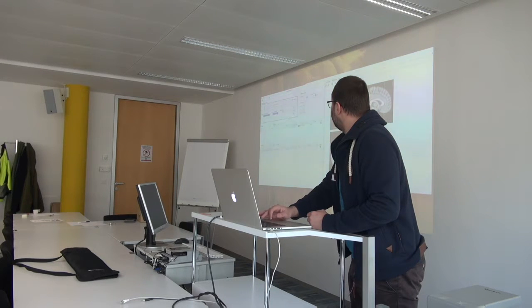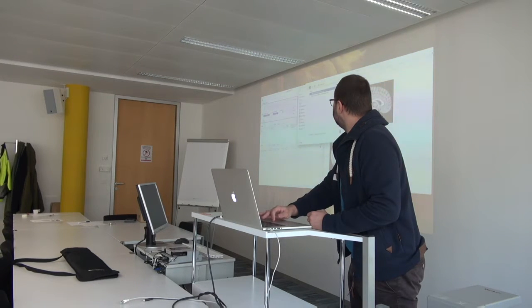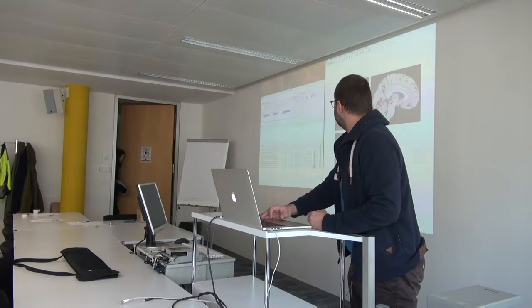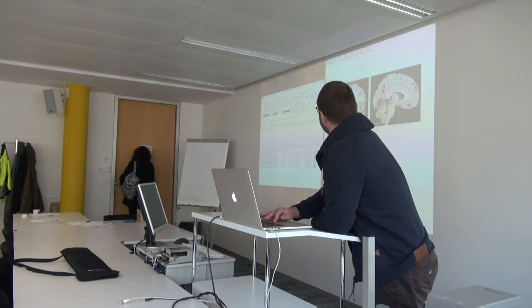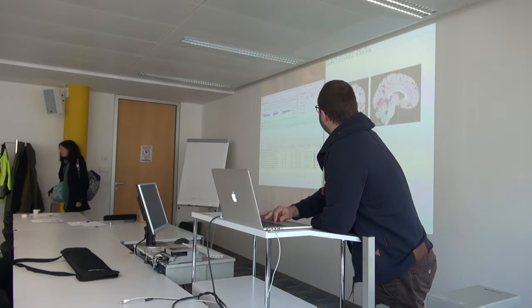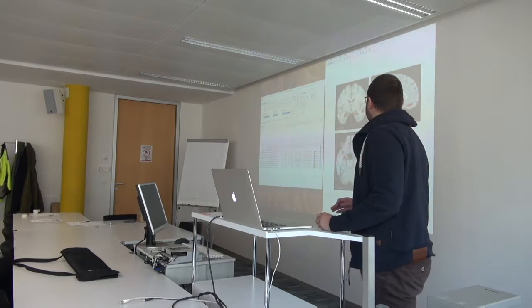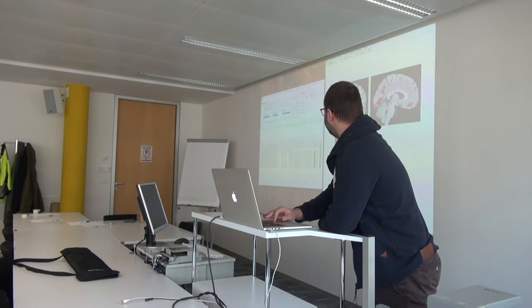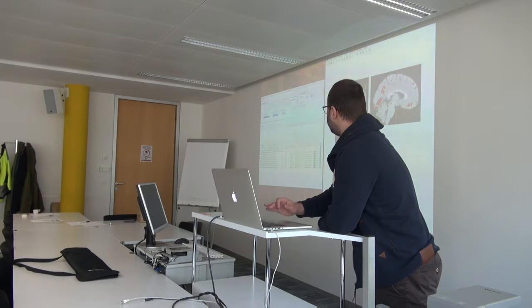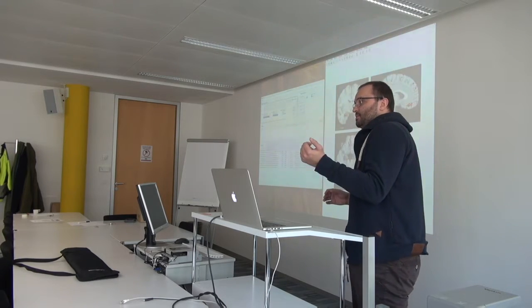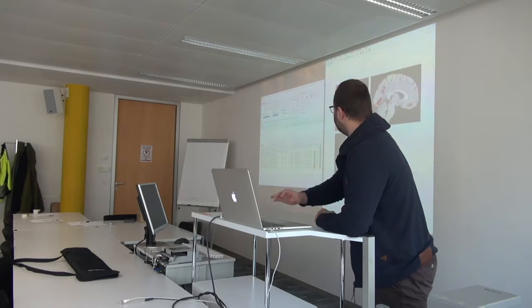Let's look at a more complicated project and open a project file. These are the axial slices I've used. This is the location of the bed nucleus of the stria terminalis, and this is the location of the amygdala — already triplanar pre-selected. Here you see the different overlays I've been using. For example, this is a SPM T-map, already cluster-level corrected. You just create your statistical maps, save them from SPM, and then use them here.